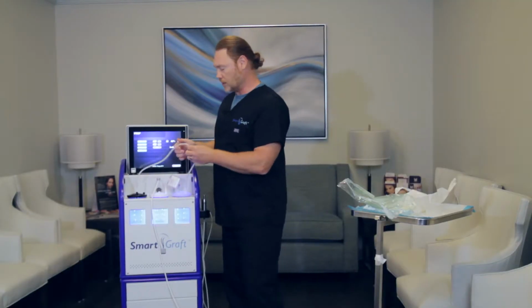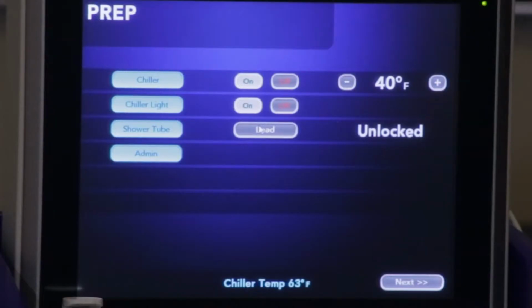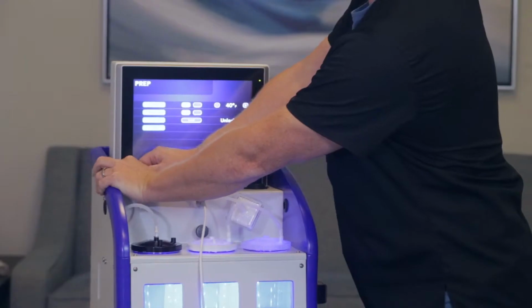Now to load this correctly on this first screen, it says shower tube. You want to hit load where it goes unlock, and you just want to push this tube in until it clicks.